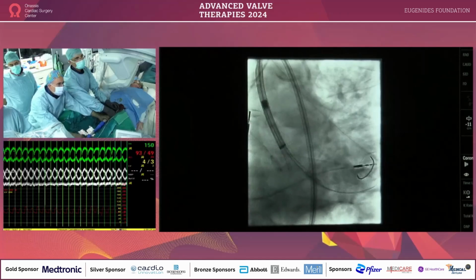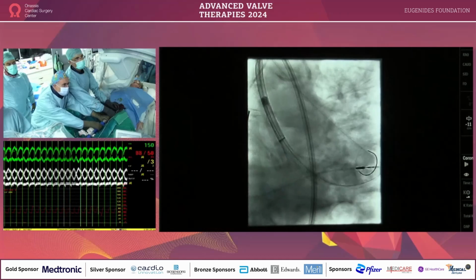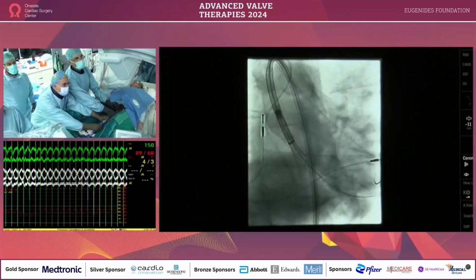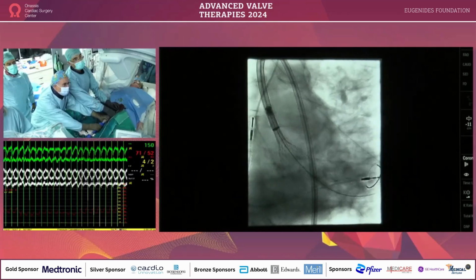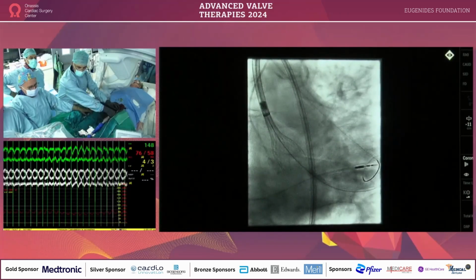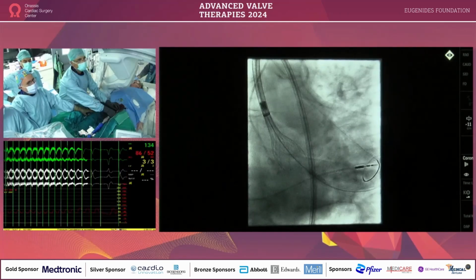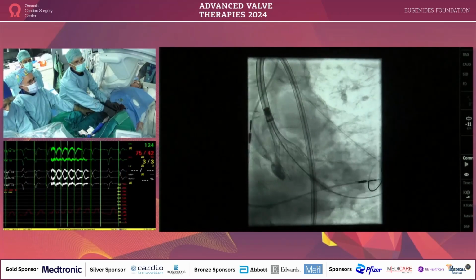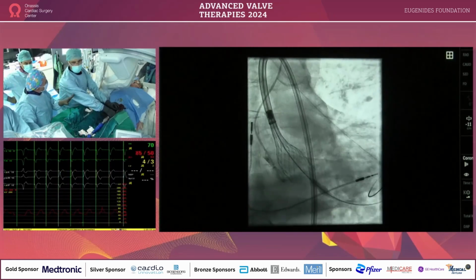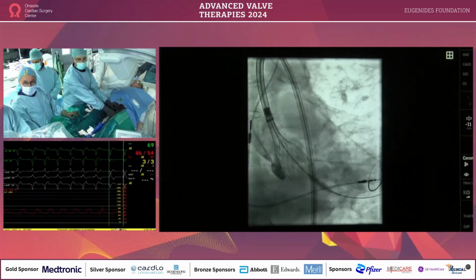Okay. Injection again. Keep going fast. Injection while he's going fast. Anesthesia doesn't help at all. Keep going. Stop there. Okay, stop with a push and pull the wire a little bit back. This is going up again. It's okay. I think that's good. Just pull the wire a little bit so it won't push it up. I think it's fine. Let's see the Coplanar view.